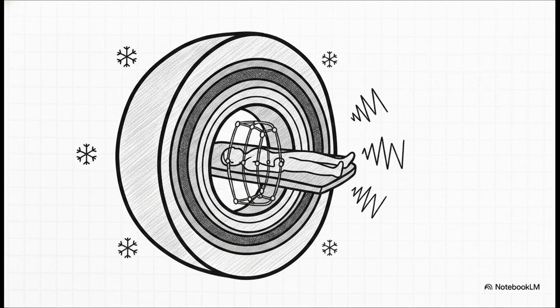Nestled inside that, we have the gradient coils. Remember those spatial encoding steps we just talked about? Well, these gradient coils are physically switching on and off thousands of times per second to encode that spatial data. That rapid, violent switching is exactly what causes those incredibly loud, knocking sounds patients hear during a scan. Then we have the phased array RF coils, which act as antennas placed right up close to the anatomy to transmit the RF pulse and listen for that delicate returning signal. And of course, the cryogen system keeping the whole main magnet perfectly, continuously cooled.